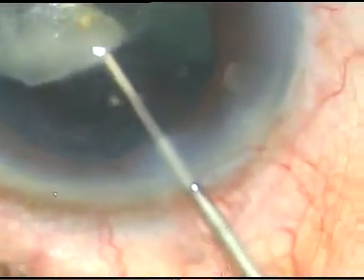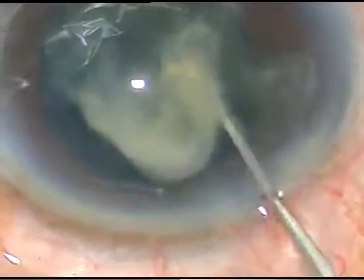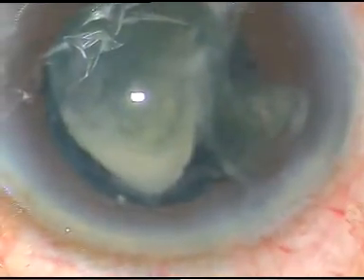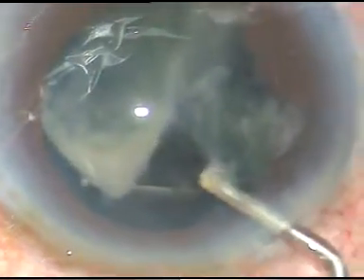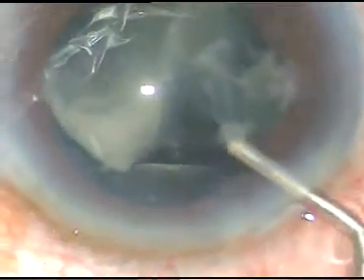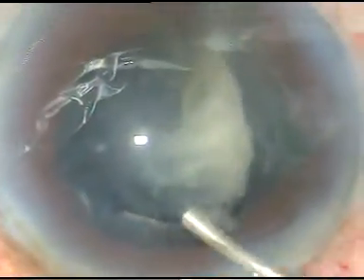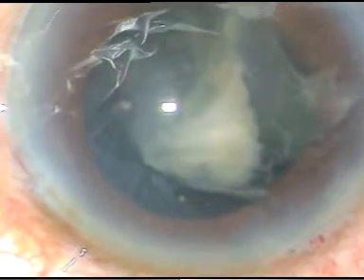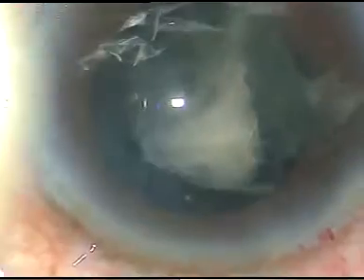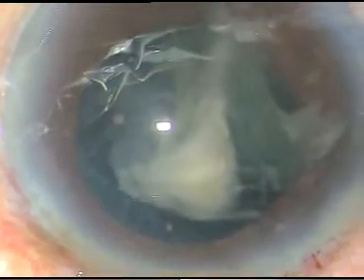I try to elevate this epinuclear sheet now, and my plan of action is to inject viscoelastic substance underneath and try to emulsify it and take it out. Since this is epinucleus and it is not nucleus, I may be able to remove it by gentle use of ultrasonic energy, low vacuum, low flow rate.